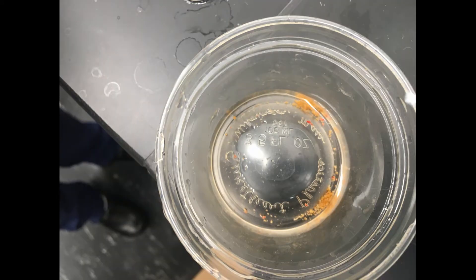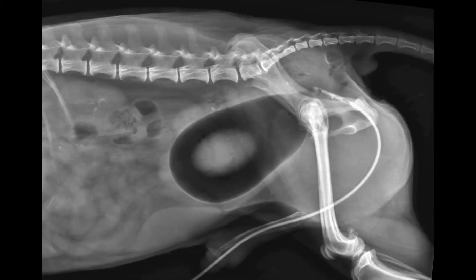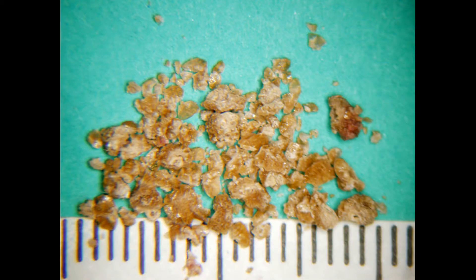Here's a picture of the stones we removed by voiding urohydropropulsion. We reinserted the scope, and you can see that all the stones are removed. The debris is coagulated protein. The dog was then taken to radiography, where survey radiographs were unremarkable, and a double contrast confirmed complete removal of the stones.